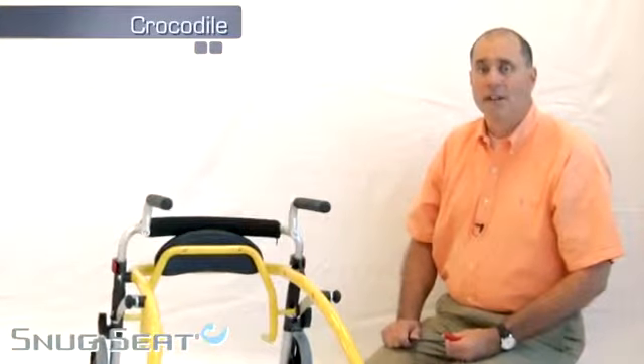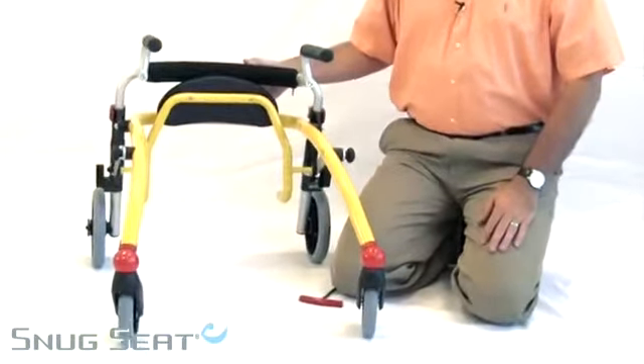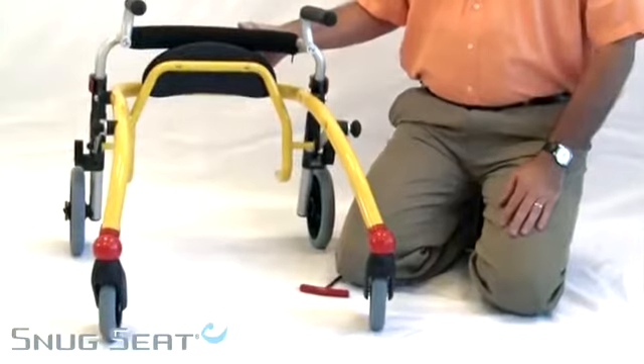Hello, my name is Derek and I'm with SnugSeat. This is a Crocodile size 1. The Crocodile is available in three sizes and they share a lot of the same features.